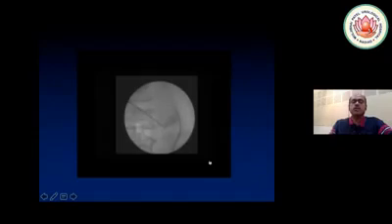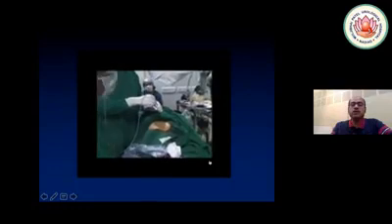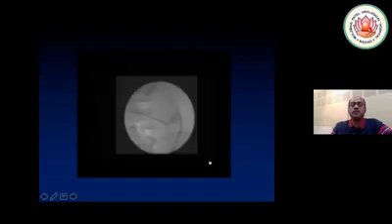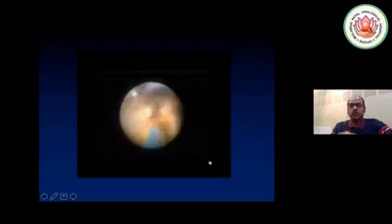As you know, microperk is just a needle which you have to puncture. There is no question of putting a wire. There is no question of putting a dilator or anything. Once you puncture it, you just have to take out the inner sheath and put a telescope, and you are inside the kidney and your job starts. So this is how we gave the tilt position, and this is how we started the micro PCNL in the ectopic kidney. This is the vision you get. And the stone was very clearly seen through the lower calyx approach, which was very easily seen on ultrasonography.